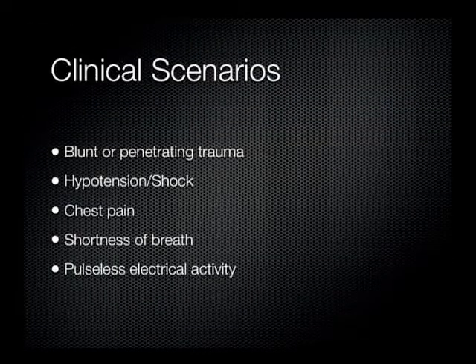The purpose of the focused cardiac ultrasound examination is to help the clinician evaluate a patient presenting with cardiac trauma, hypotension, chest pain, dyspnea, and pulseless electrical activity in the emergent setting. Those of us who evaluate and treat patients in the emergent setting know it can be difficult to obtain a complete cardiac ultrasound performed by an echocardiologist in a timely manner.